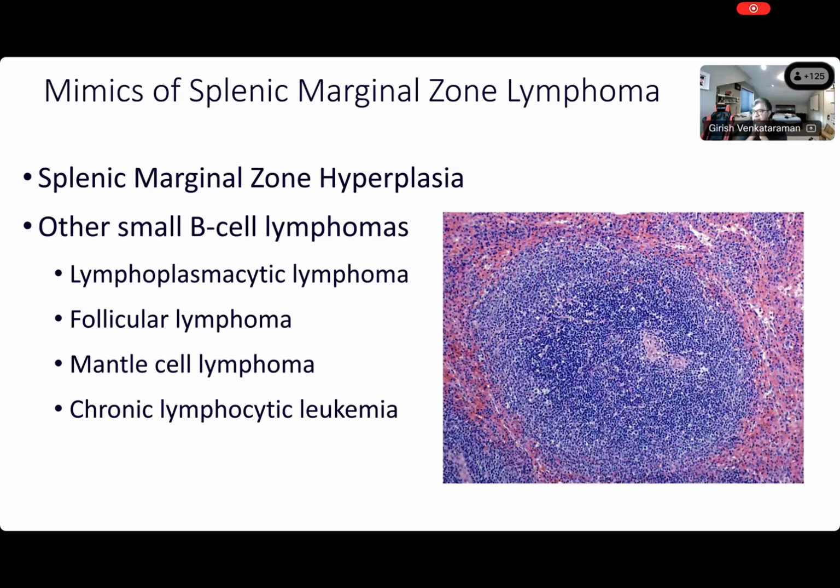I'm showing you something on the right. Now I'm looking at that picture. Can I really make a guess what this could be? Could it be any one of these alternate lymphomas? Yeah, it could be, but I cannot make a call. But what I can tell you is there's a lot of red pulp involvement by something over there that kind of catches my eye.